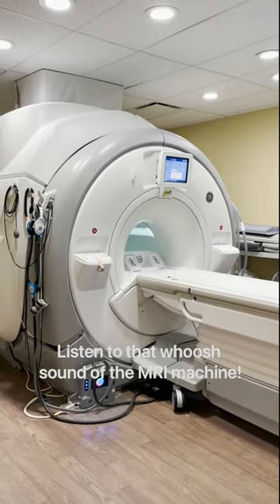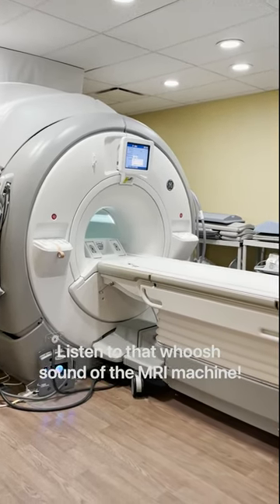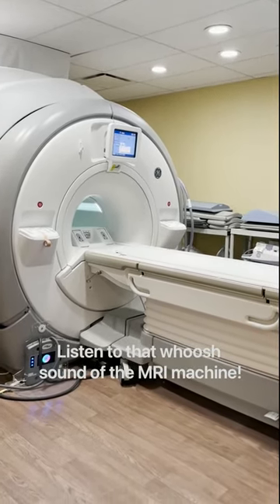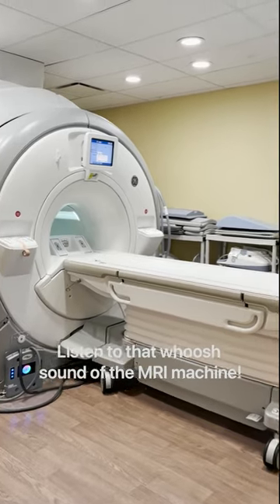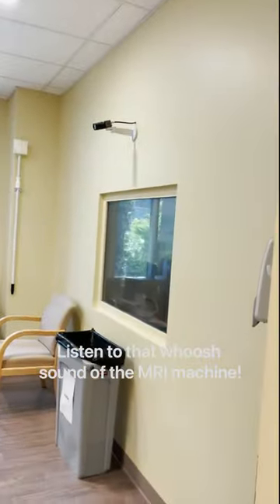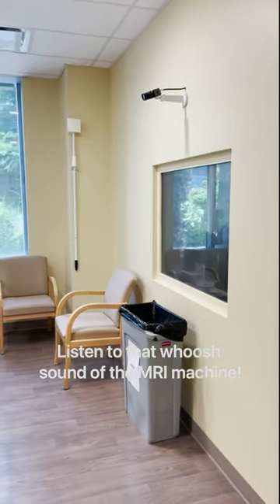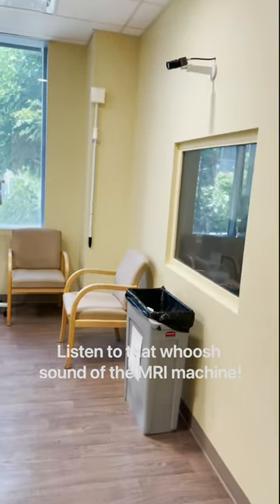If you are awake during the MRI, you will probably hear loud banging and knocking noises even if you are wearing earplugs. The MRI staff will be watching you carefully in the control area while you are getting your pictures taken, and you will be able to talk to them through an intercom.